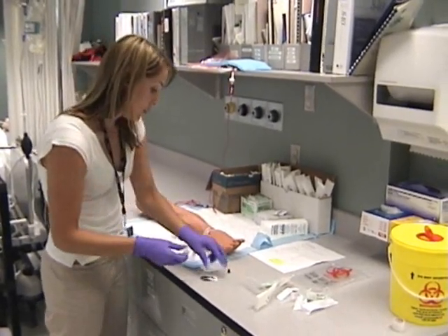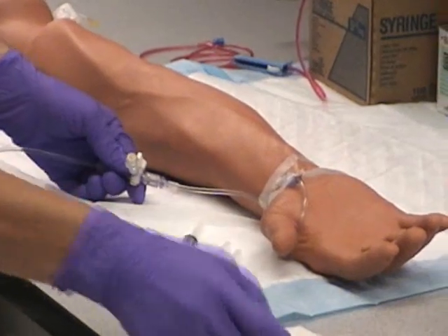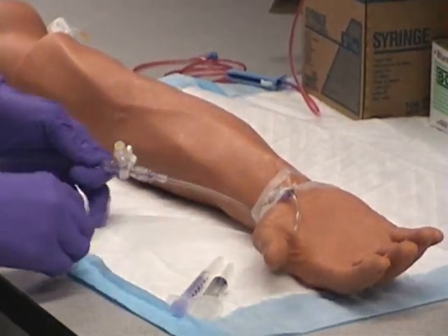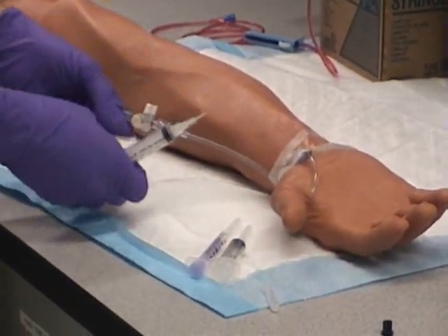The first step is to alcohol the procedure site. It is a little rubber port — you want to alcohol it clean and let it dry for 30 seconds.